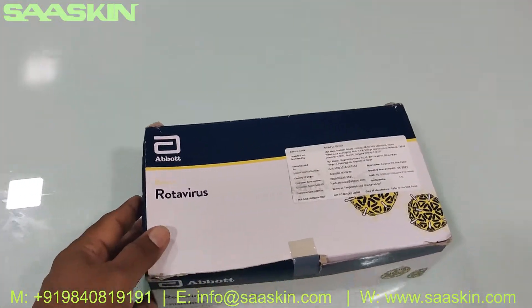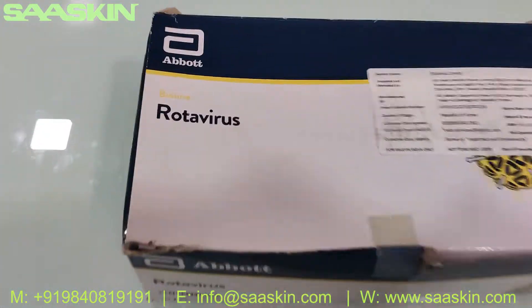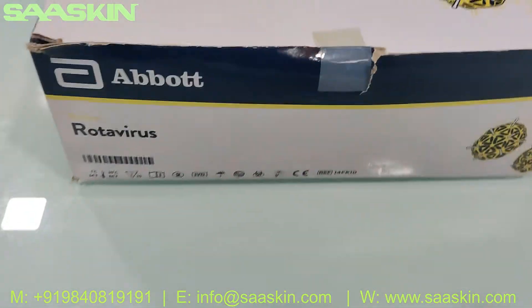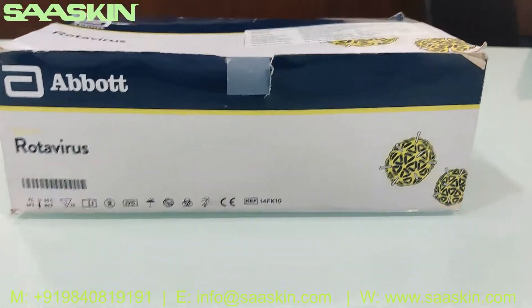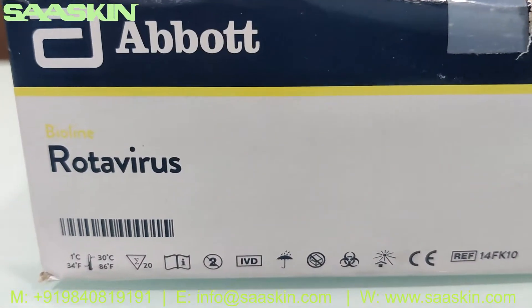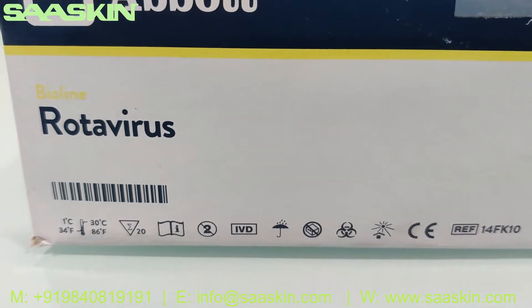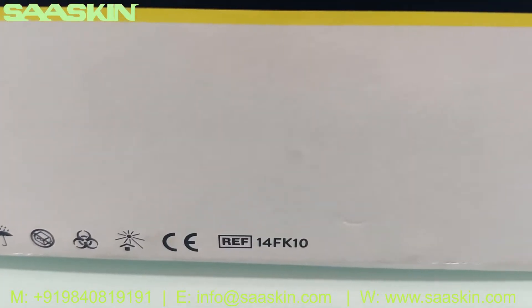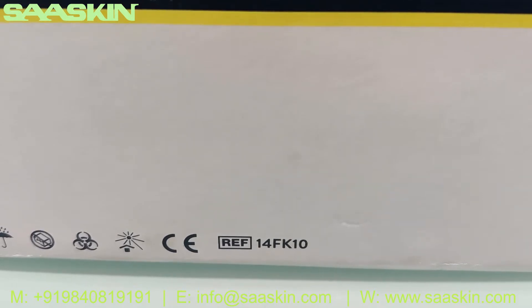Hello everybody, today we're going to see the unboxing of Abbott BioLine rotavirus test kit. This is how the total box looks like — you can see that it is Abbott BioLine rotavirus. This is the 20 test kit pack, a CE certified product, and this is the catalog reference number: 14FK10.